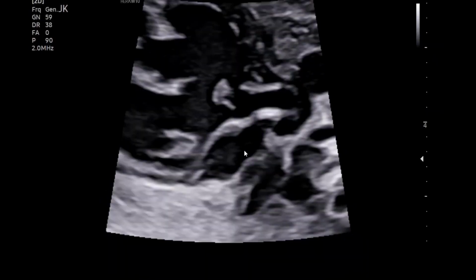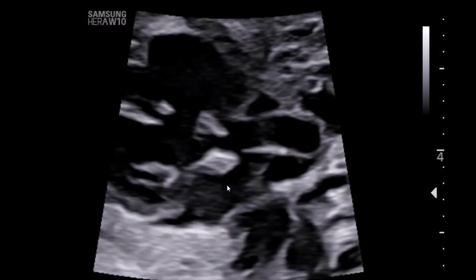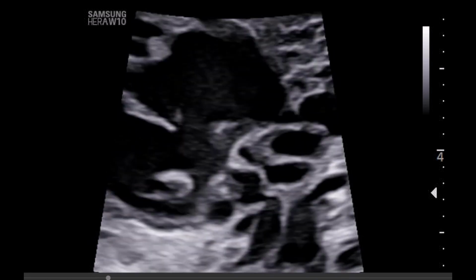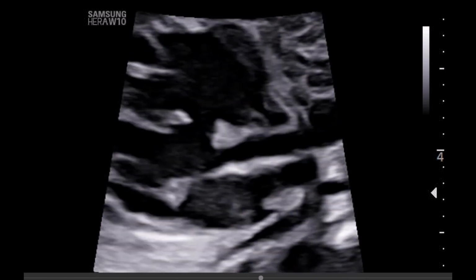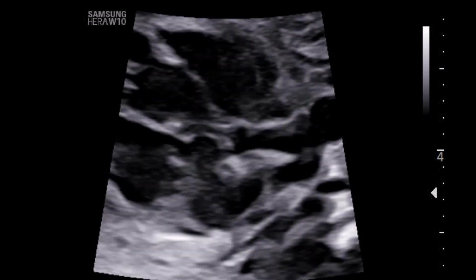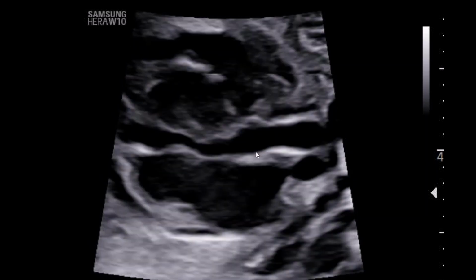And so here we get a nice close-up view, frozen, of the aortic valve leaflets closed, and you can see just how narrow that subaortic region is. And then here in motion, you can see the aortic valve leaflets opening during systole and just how narrow that subaortic region gets. Another really good look at that in this view here.